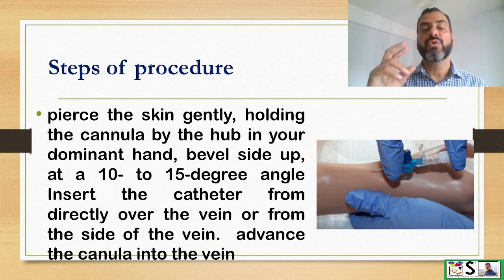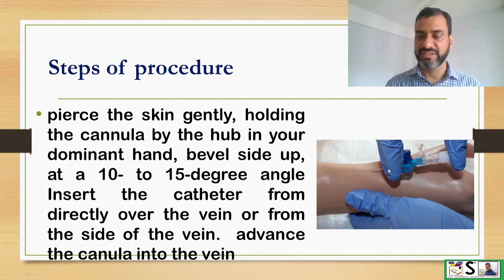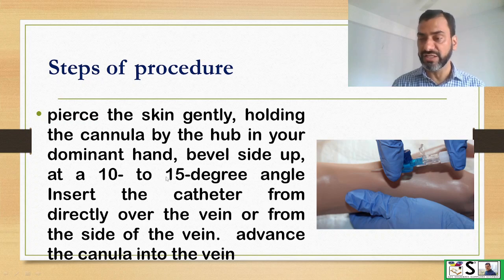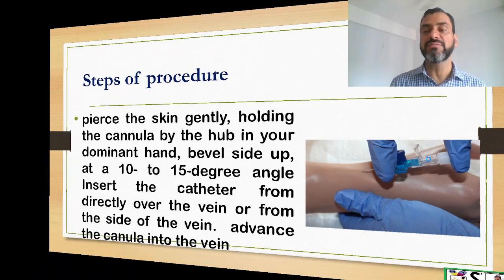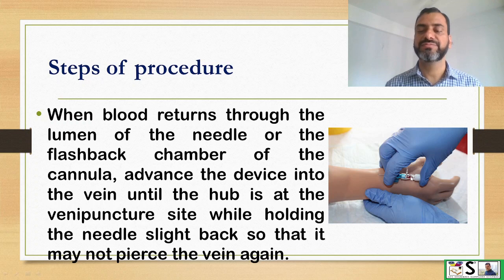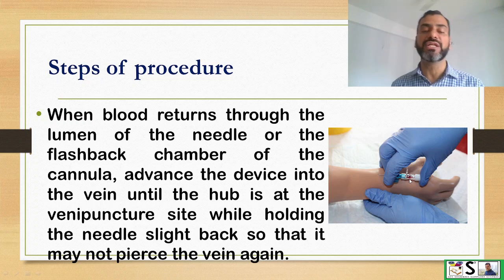Pierce the skin gently, holding the cannula by the hub in your dominant hand, at a 10 to 15 degree angle, and insert the catheter directly over the vein or from the side. Advance the cannula into the vein until blood is seen at the hub — this means the cannula is in the vein. When blood returns through the lumen of the needle or in the flashback chamber, the venipuncture is successful.